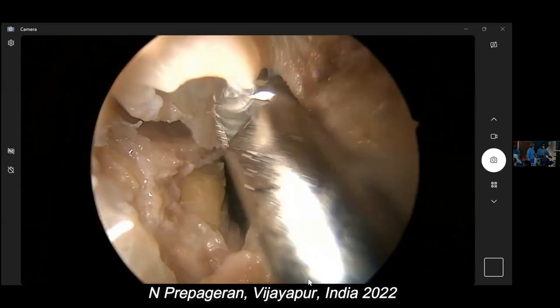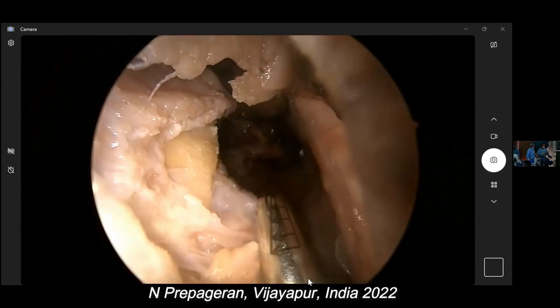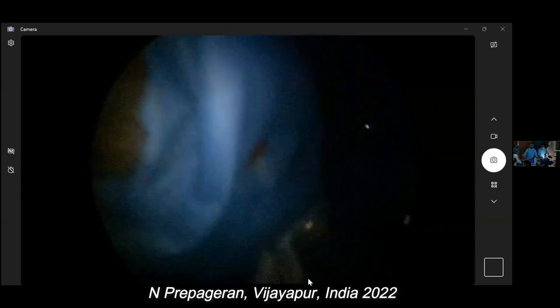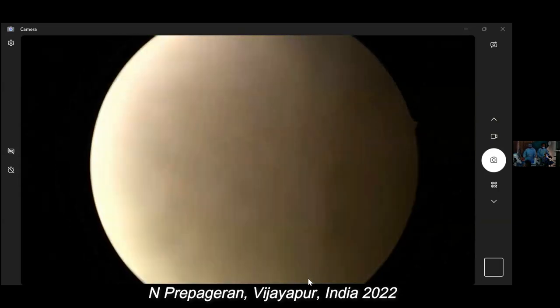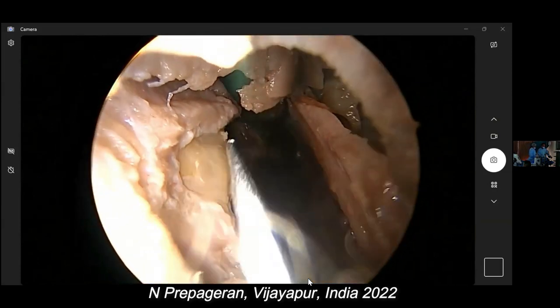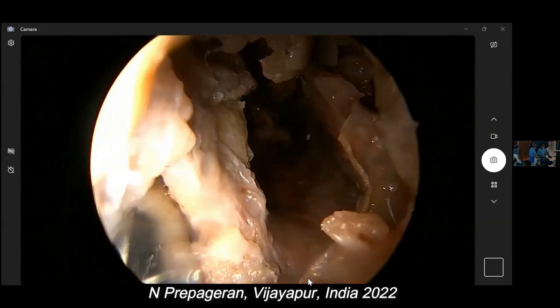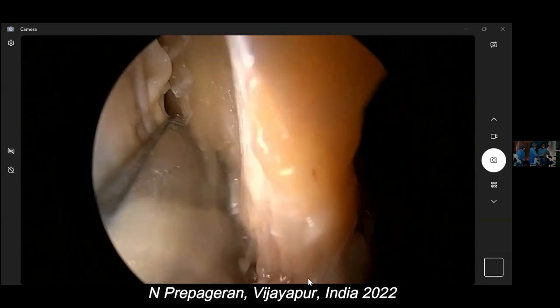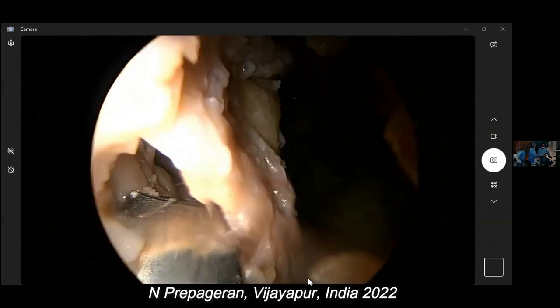Okay. So now, can you see, guys? Okay. Can I have a chisel? So when you do Denker's, you must be subperiosteal. If you're not subperiosteal, you will have ala deformity.